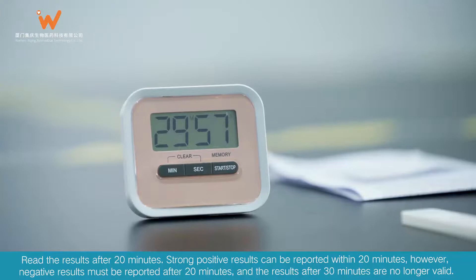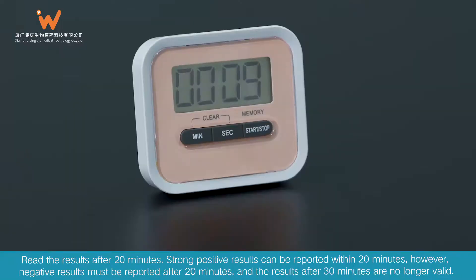Read the results after 20 minutes. Strong positive results can be reported within 20 minutes; however, negative results must be reported after 20 minutes, and results after 30 minutes are no longer valid.